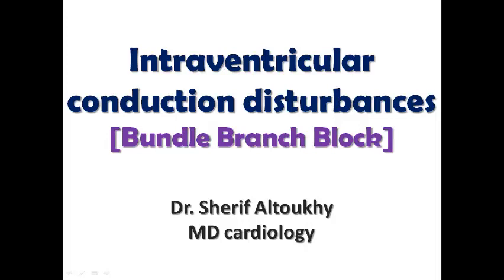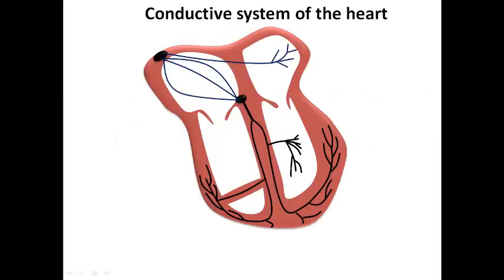Hello everyone and welcome to this new lecture in our ECG course. We are discussing today a new topic regarding intraventricular conduction disturbance, and we are focusing on the first part of this topic, which is the bundle branch block. Let's start our talk today with a brief discussion regarding the conductive system of the heart.